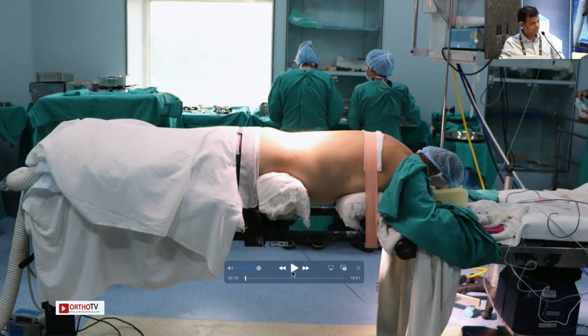But with the floor-mounted system, this is less of a problem because it is navigation-based. You have that tracker on the iliac crest, so even if the patient moves, it knows that it has moved. Yeah, Bauk is using the floor-mounted robot. So that's the advantage, rightly said. We put a dynamic reference-based array on the iliac crest. So in true sense, the robot maintains the navigational integrity, even with movement.